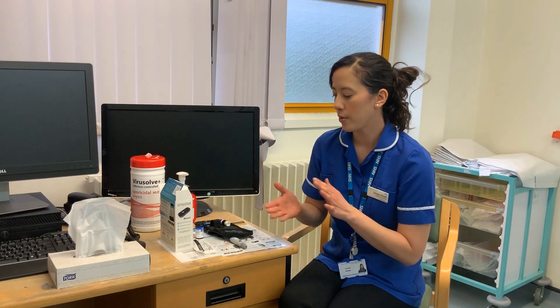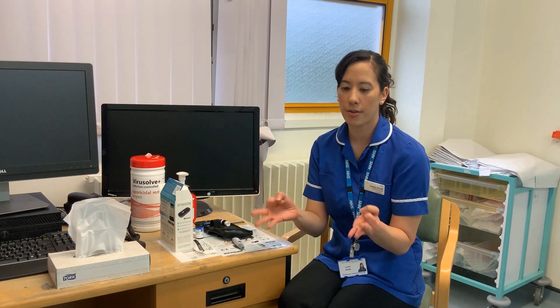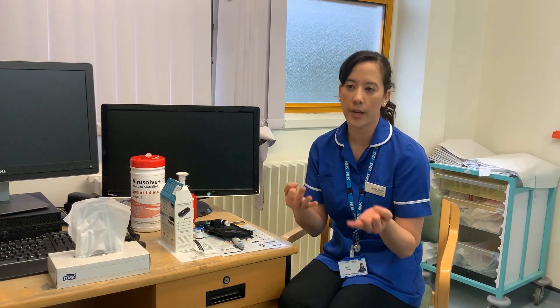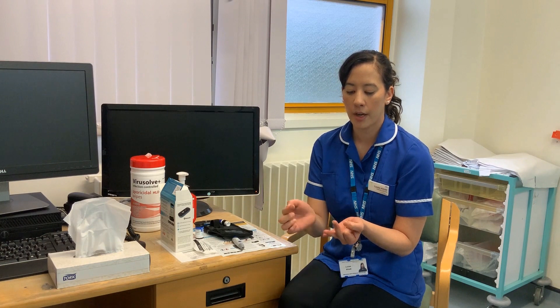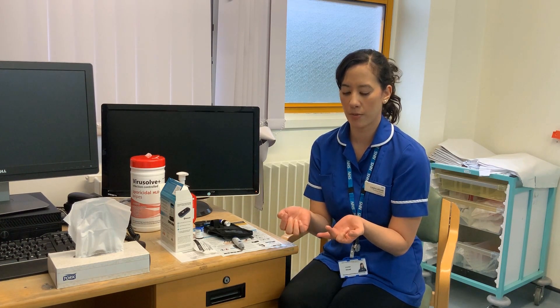When you're testing, you would always use the last three fingers on either hand and just alternate which fingers you're using to give them a break in between. Always test on either side of your finger and avoid the tip or the middle pads, as these are the most sensitive parts of your finger.